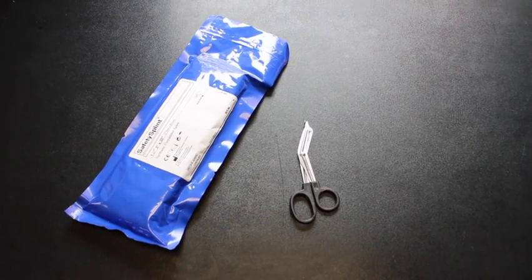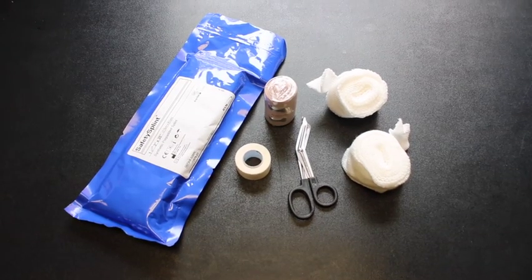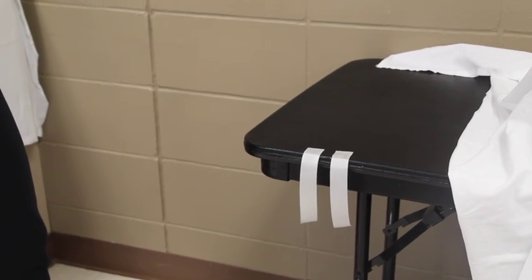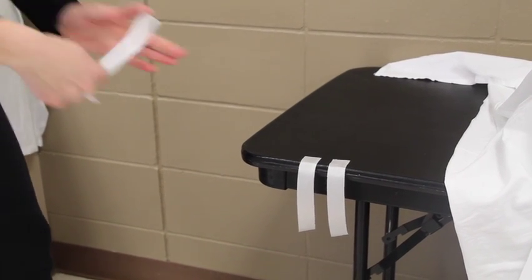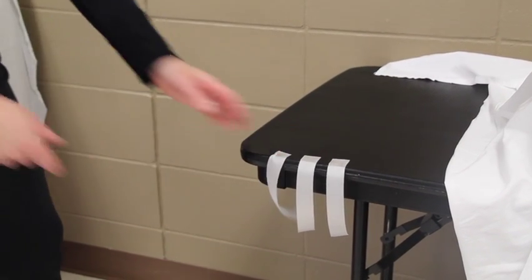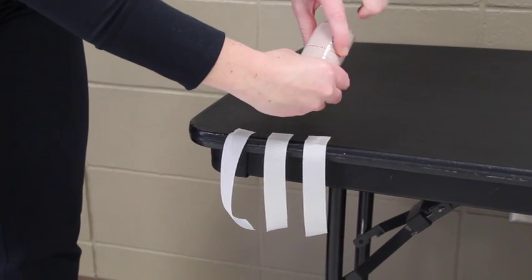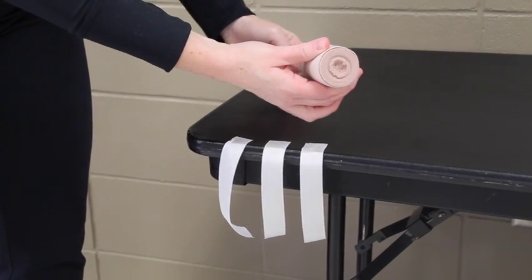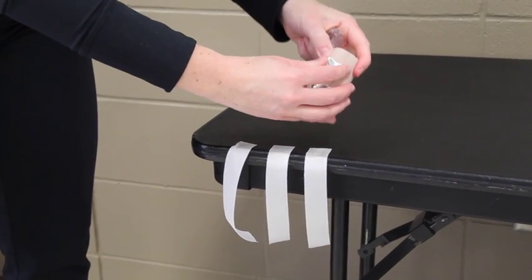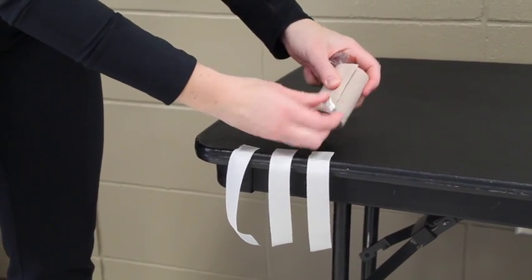Materials needed: a ready-made splint, scissors, 2-inch padding, tape, and 3-inch elastic bandage. Tear off some pieces of tape so they are within reach at the end of the splint. Then open the elastic bandage — some packages have a red dotted line in the middle; twist to open the plastic, it's much easier to take off. I recommend taking those sharp clips and throwing them in the garbage, as they tend to hurt people.